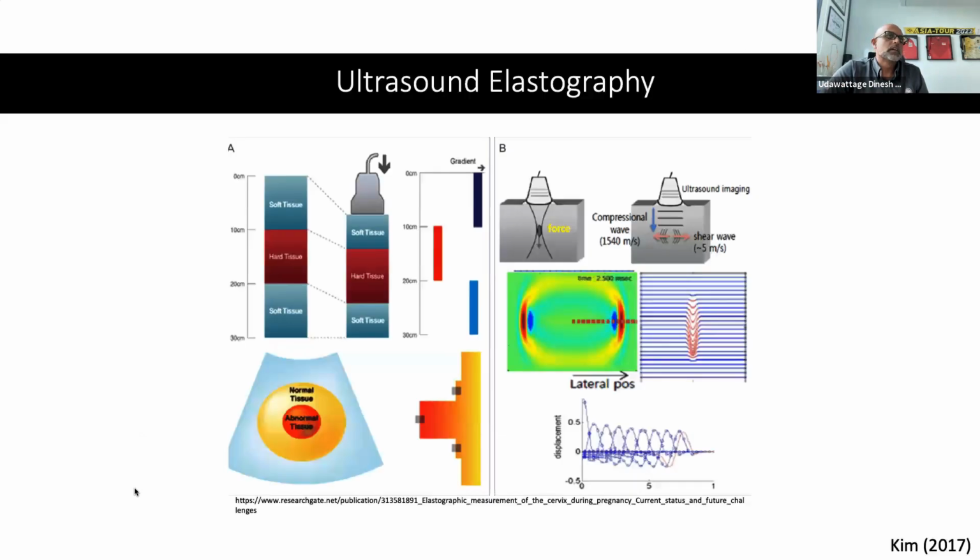However, one of the other things that I have started doing with these muscle injuries is using elastography to complement clinical assessment after treatments and for recovery and so on. So ultrasound elastography, for those of you who have dealt with liver tumors or breast tumors and so on, is where the ultrasound probe, but there's two types of elastography.